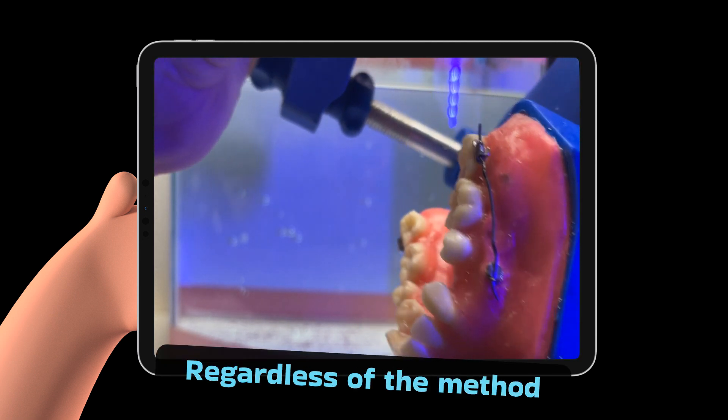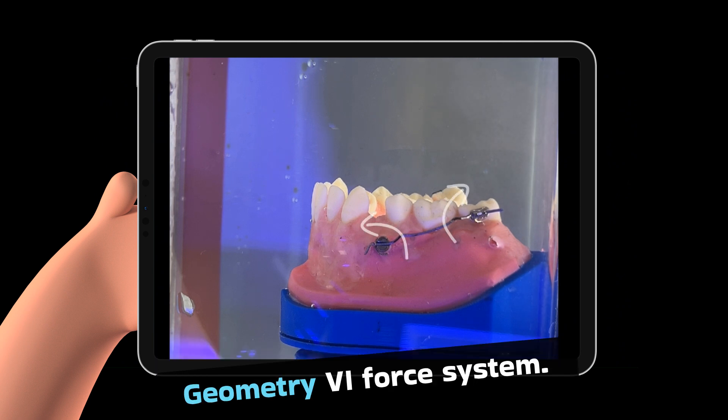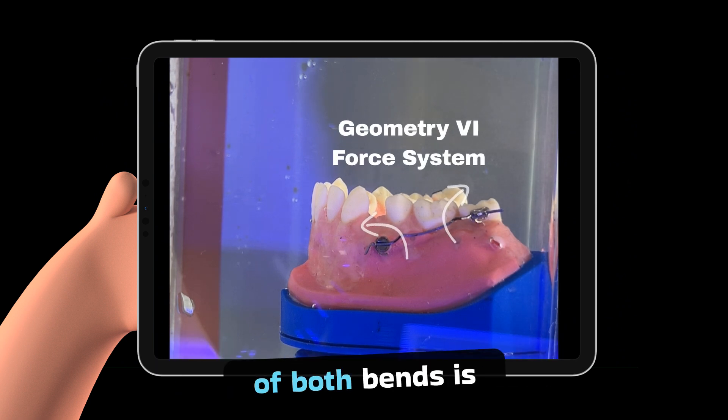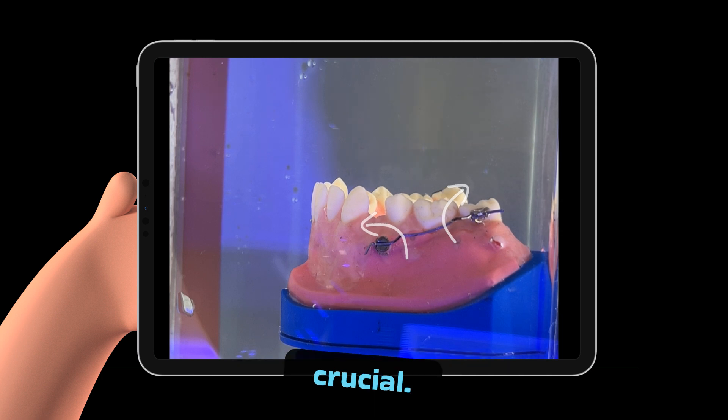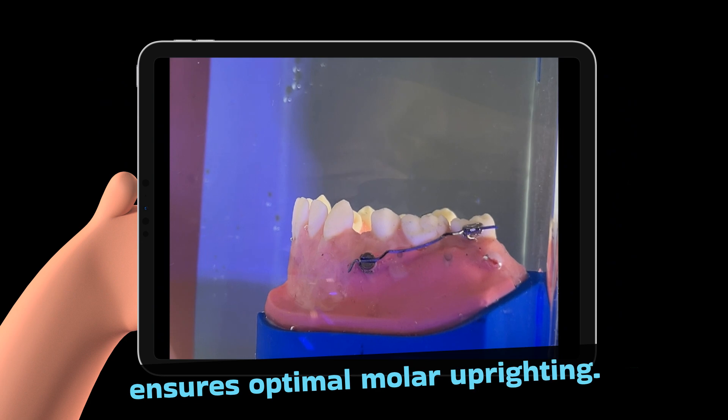Regardless of the method you choose, ensure consistent application of the geometry VI force system. Consistency in the intensity of both bends is crucial — this not only preserves the mechanics, but also ensures optimal molar uprighting.